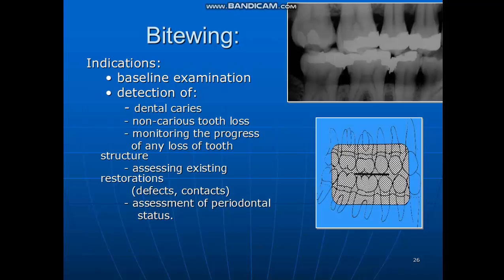During investigation, bite tabs or a film sensor holding device, as you can see here, may be used to hold the film sensor in the patient's mouth. Bite tabs are available in folding types, stick-on types, and manufacturer-applied tabs. And this instrument has the advantage of an aiming ring and rod to hold the position of the X-ray machine position indicating device.